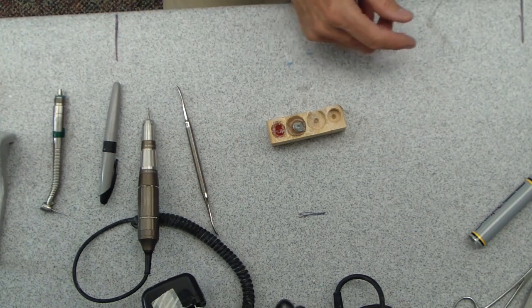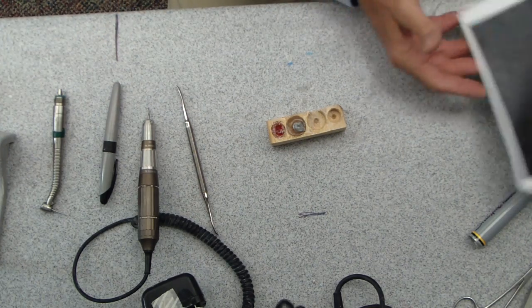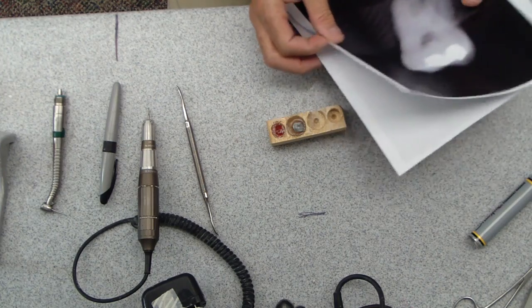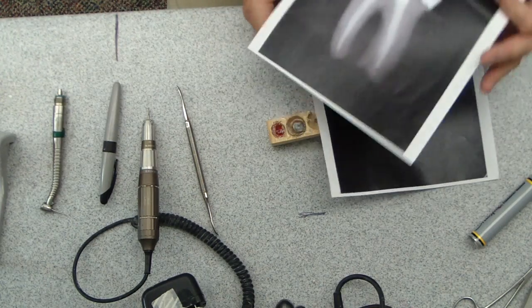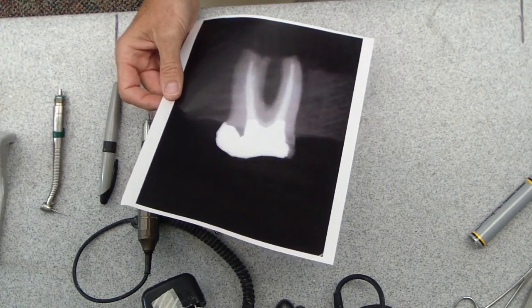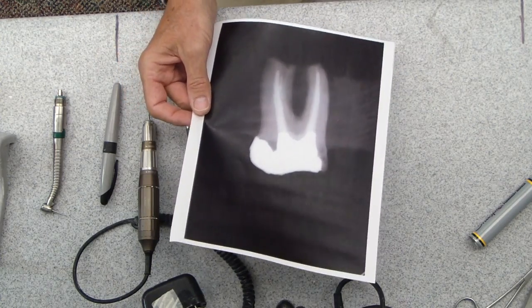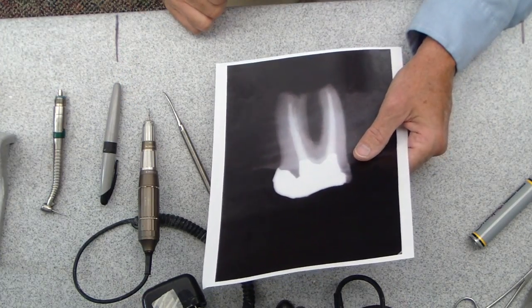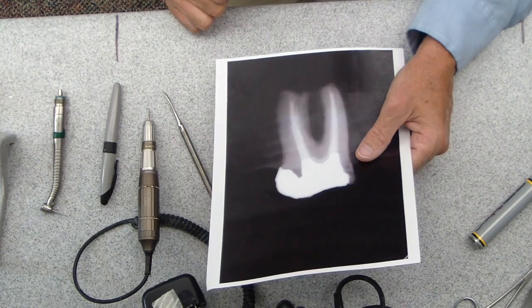The other isolated tooth that we work with quite a bit is the mandibular molars, and those can be kind of gnarly sometimes because you don't have anything to elevate on. Mandibular teeth can be pretty tough, the bone's pretty tough in there, and this is a root canal which makes it even more challenging, which means it's going to break off pretty easily.